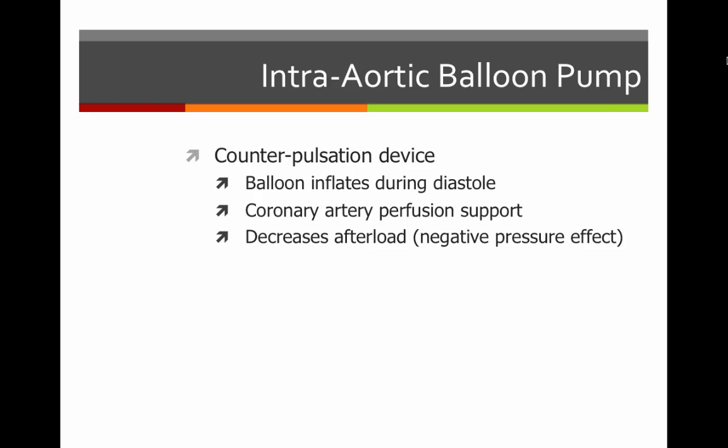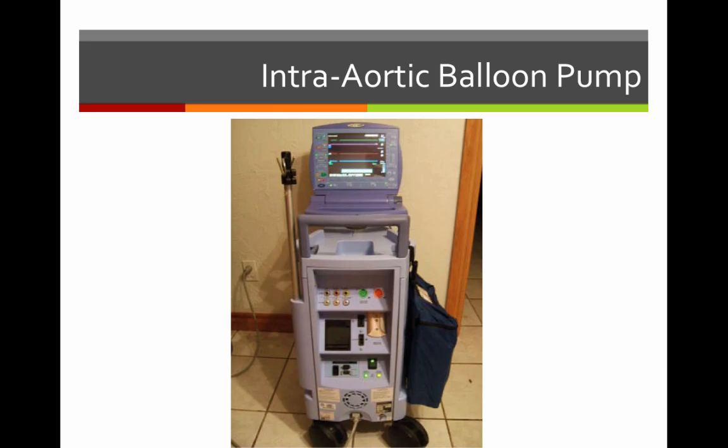So these patients have failing hearts. They're waiting for some sort of transplant, or perhaps they are pre or post operative, and they're just on this for a little bit of time. But you're going to see this balloon pump in use. You might have to transport it in certain situations. Again, you're not going to encounter this patient in the pre-hospital setting. This is going to be an in-hospital patient 99% of the time.